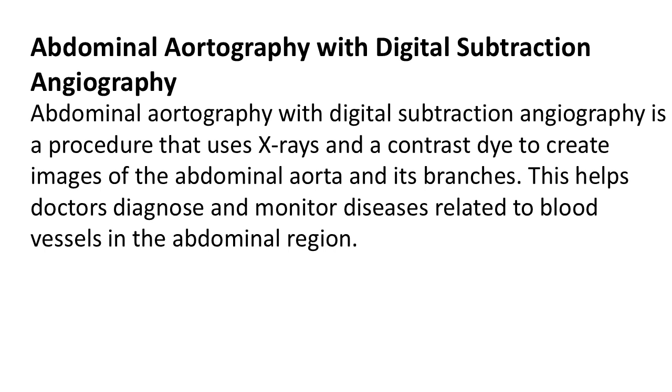Abdominal aortography with digital subtraction angiography. Abdominal aortography with digital subtraction angiography is a procedure that uses X-rays and a contrast dye to create images of the abdominal aorta and its branches. This helps doctors diagnose and monitor diseases related to blood vessels in the abdominal region.